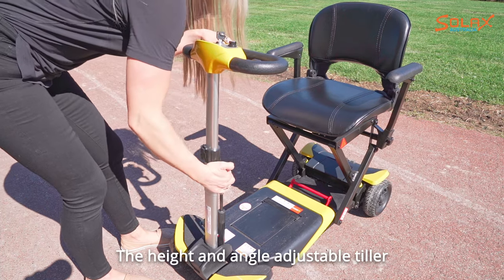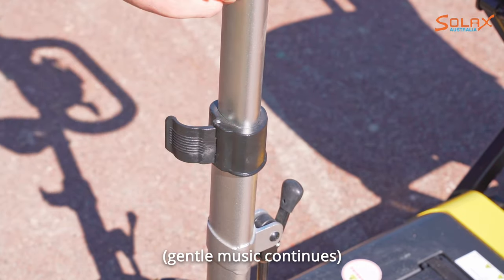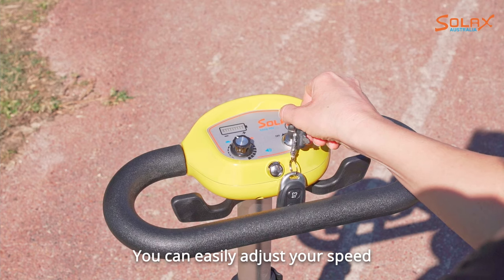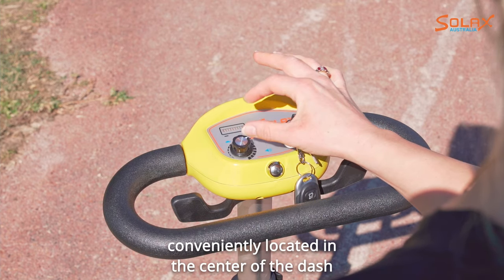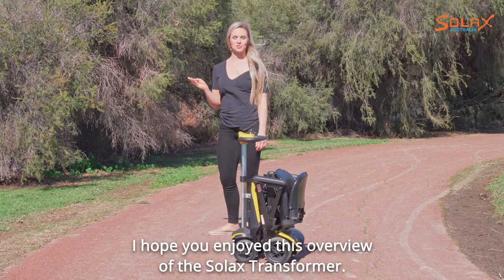The height and angle adjustable tiller will allow you to adjust to the most comfortable position. You can easily adjust your speed using the speed adjustment dial conveniently located in the center of the dash, right next to your key and horn. I hope you enjoyed this overview of the Solax Transformer.